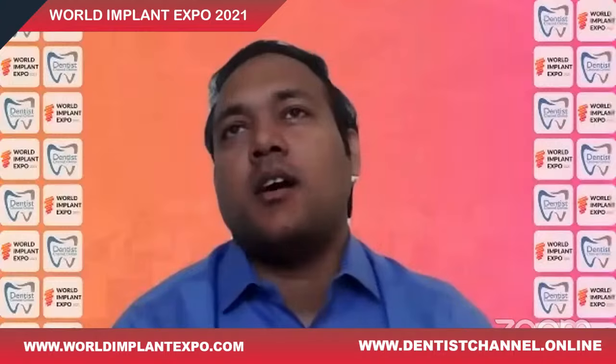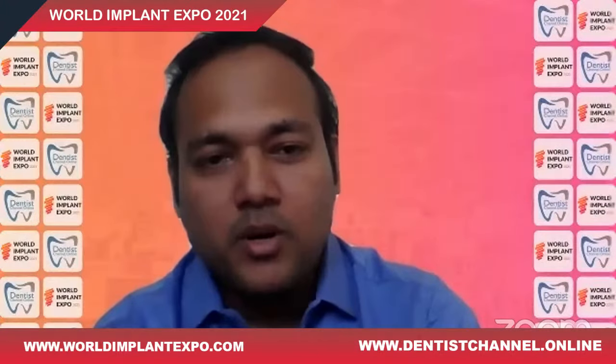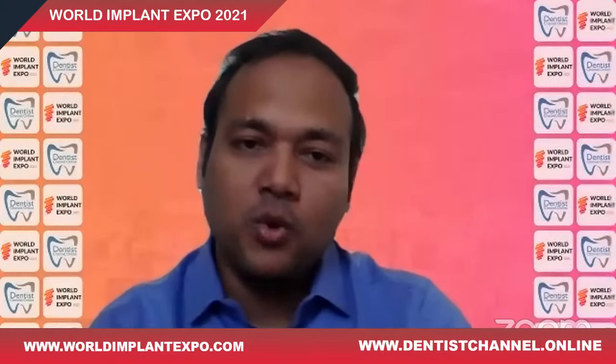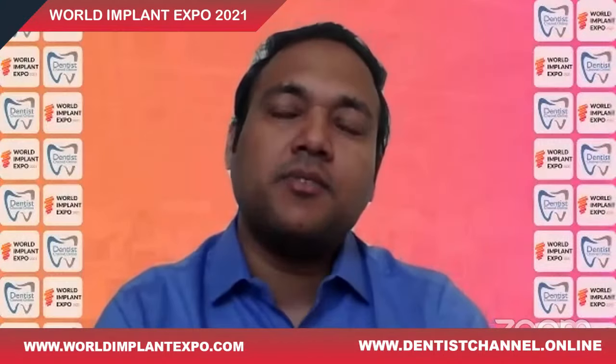Our limit of dependability on the CBCT scans is that we just get an idea of how much bone is available and where we can place the implants. Whenever a soft tissue adjacent is going to come up, I think the best known indicator is that clinically we open up and see. That would be the best assessment as far as implant placement is concerned.